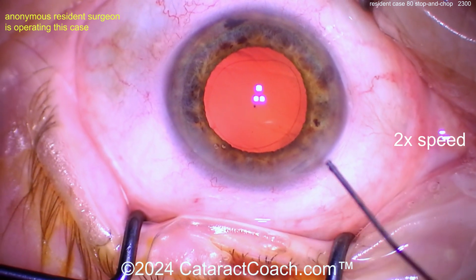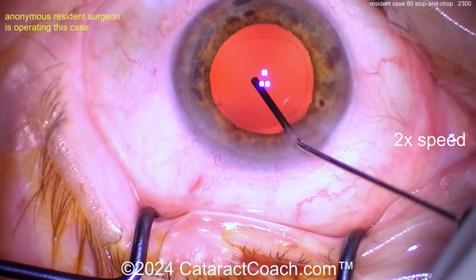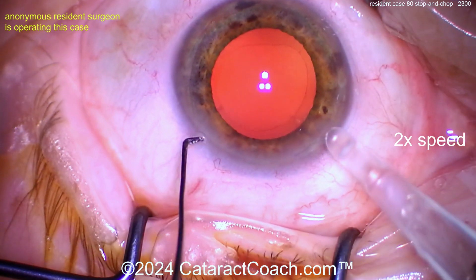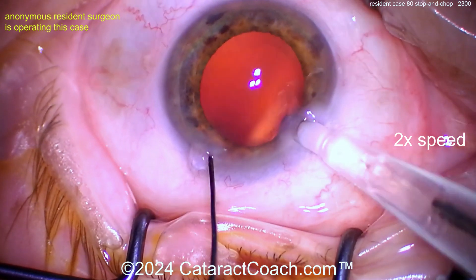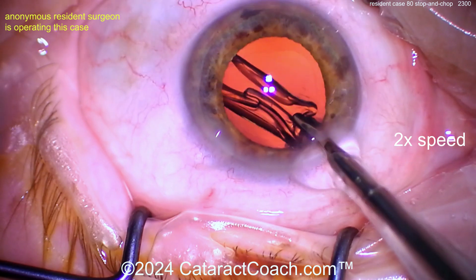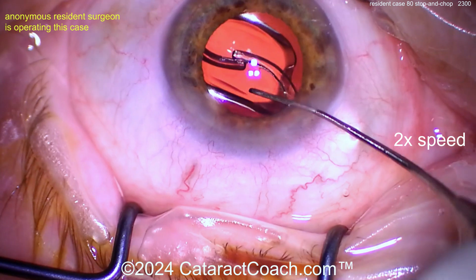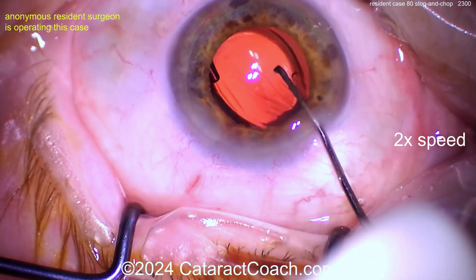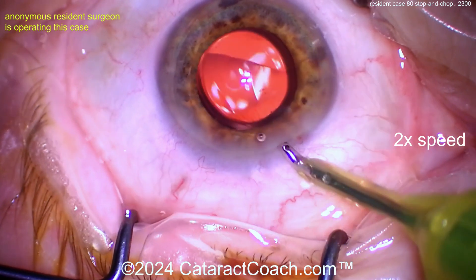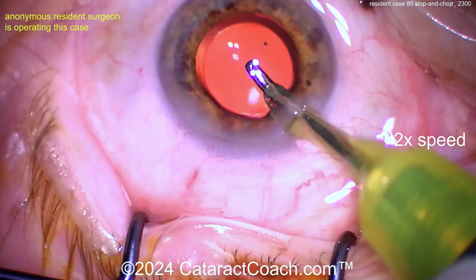Nice case so far — patient has good anesthesia. Here's some cohesive viscoelastic to fill up the capsular bag. Let's get that lens in. Looks like a single-piece acrylic lens being injected — nice and easy into the capsular bag. Look at that, opening right up. Now judging the rhexis size — it's a 6 mm overall optic, and look at that rhexis overlap. Pretty good, I like it.